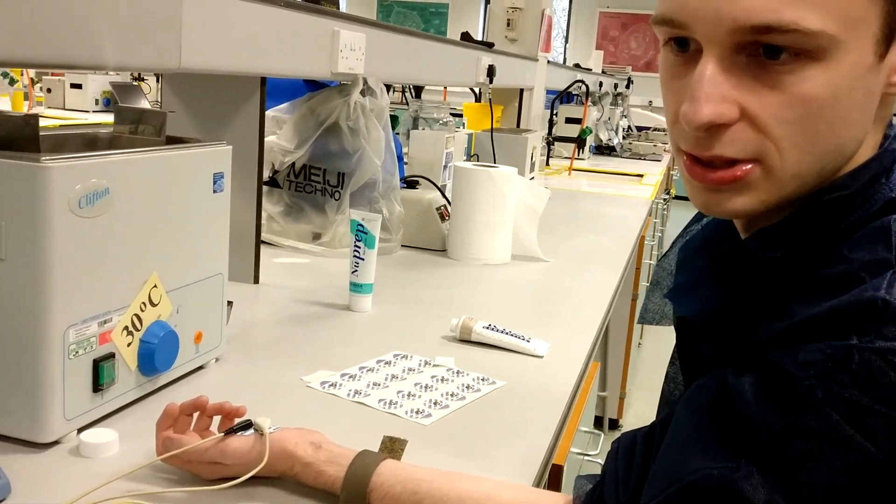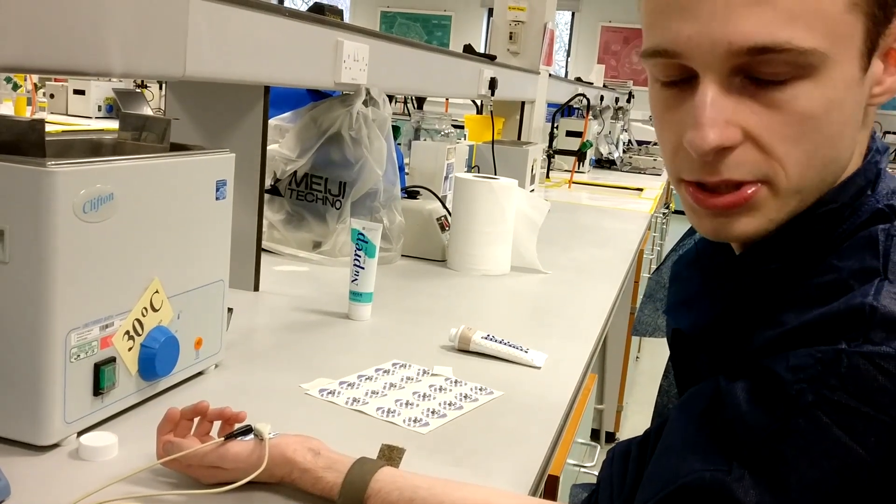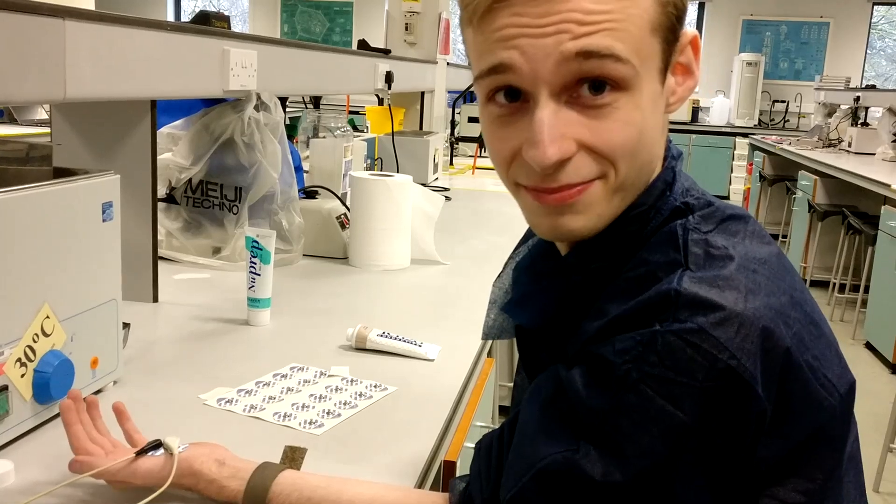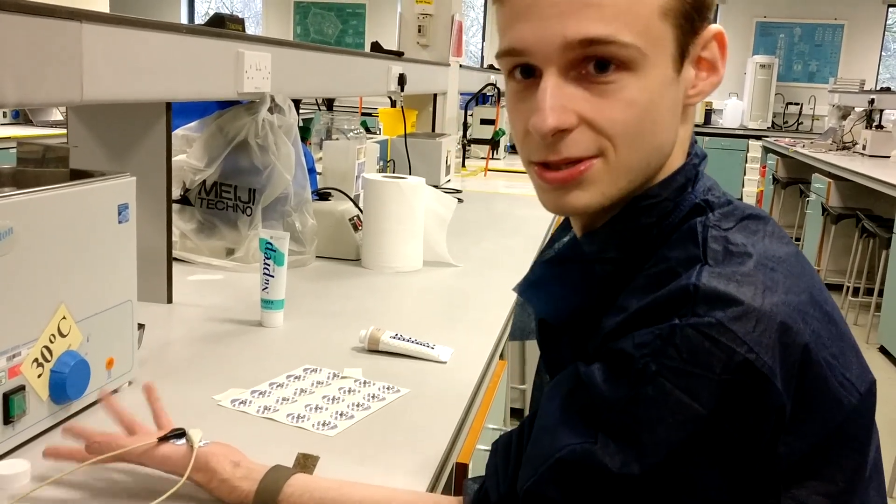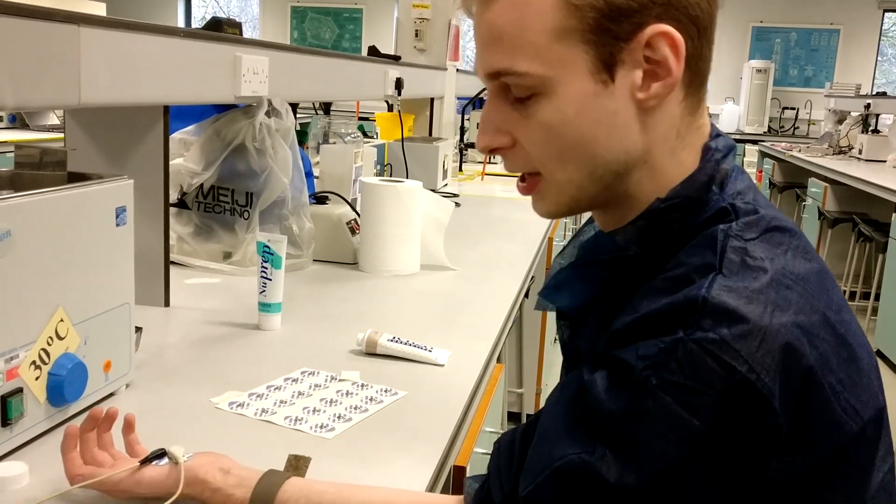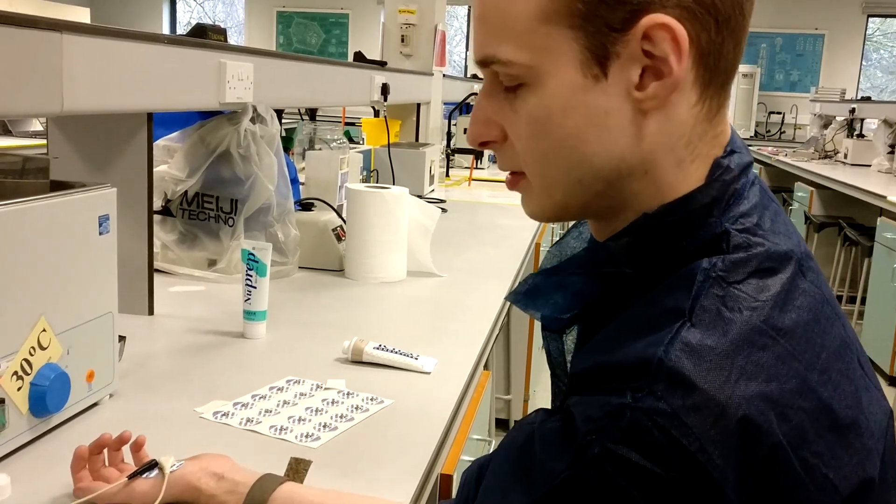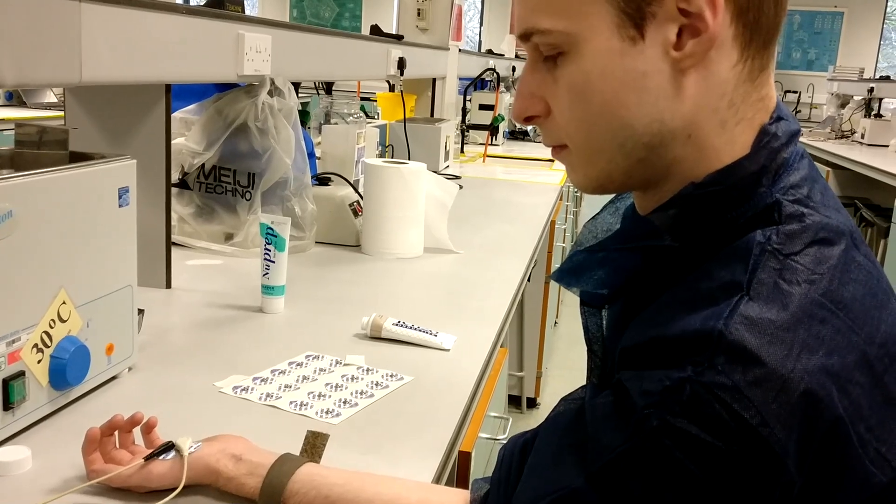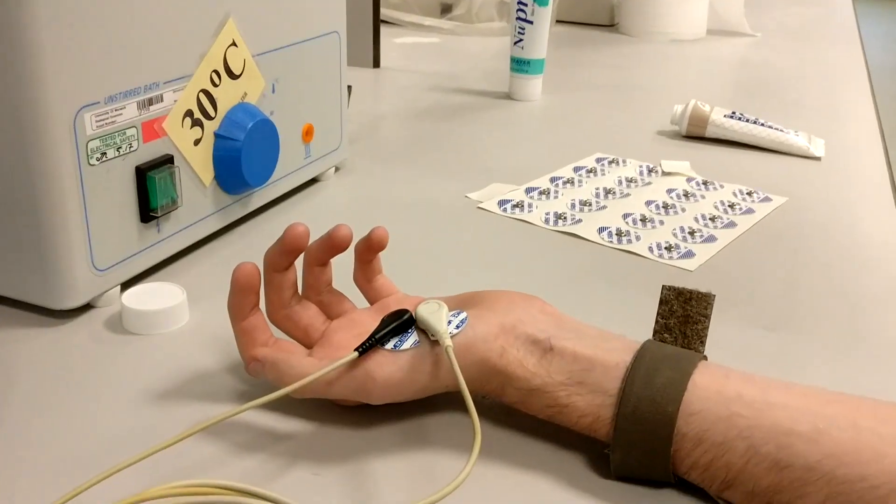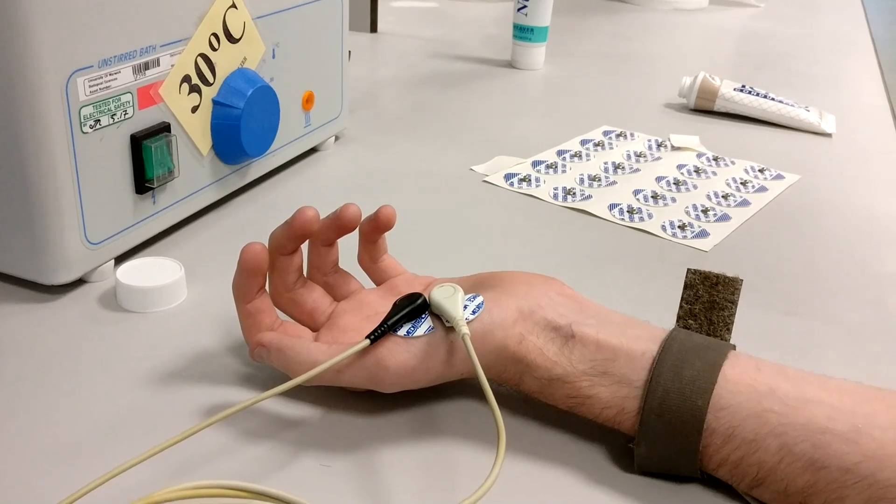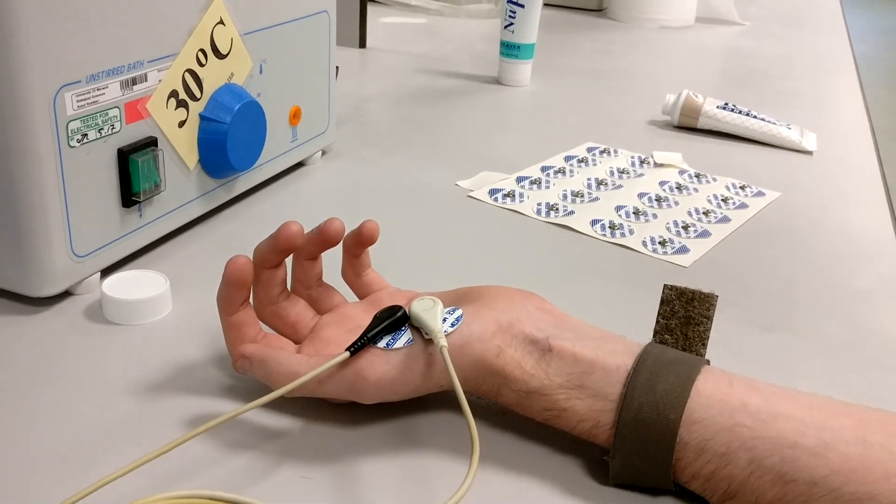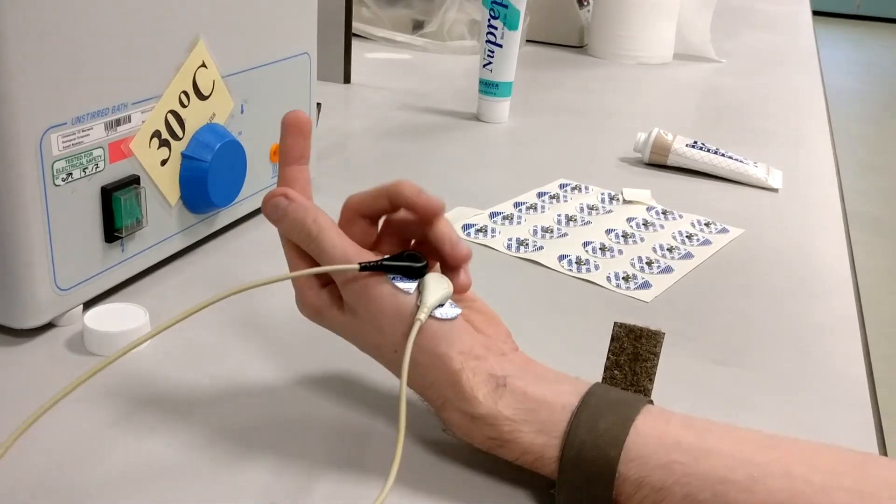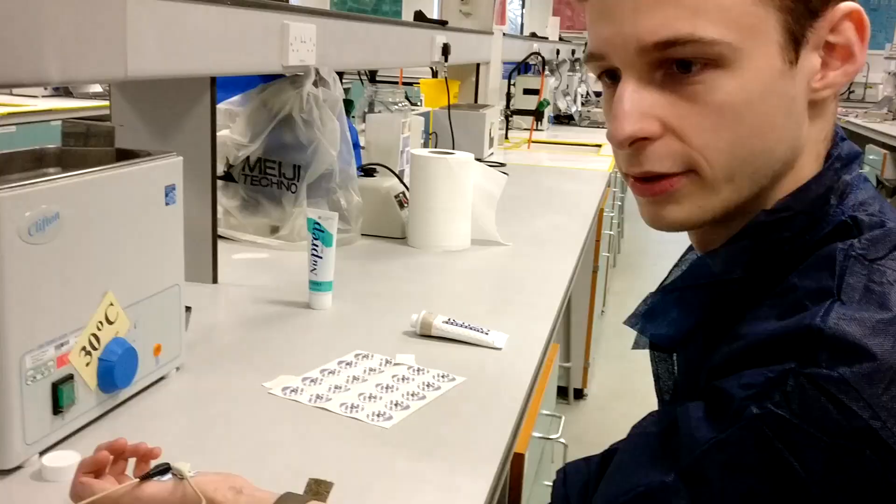Now we're going to bump it to ten hertz. This is apparently the same frequency of tremor that somebody with Parkinson's would experience. Again, in the same place, ulnar nerve. We're going to just focus up—this is ten hertz. Watch my hand bunch up when it hits. That's so unpleasant.